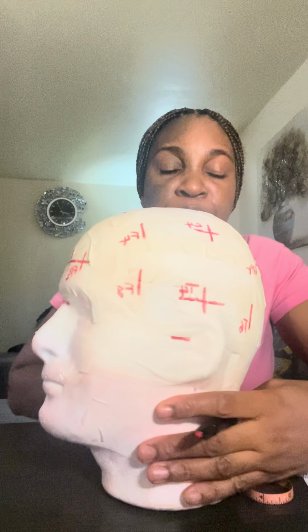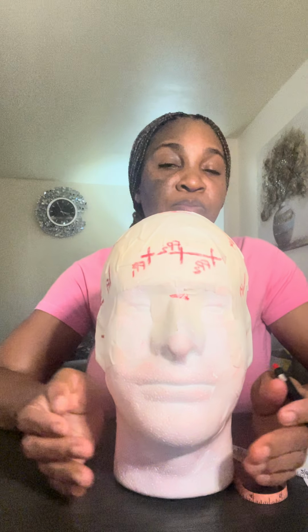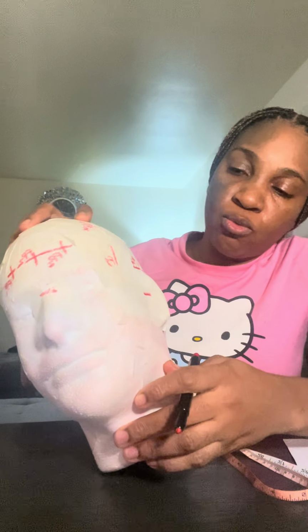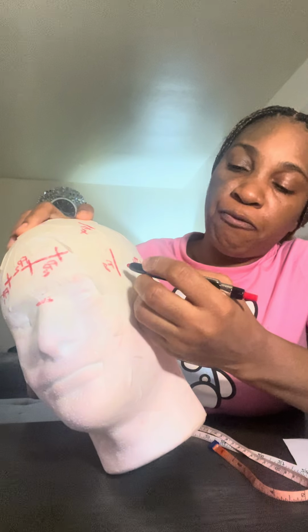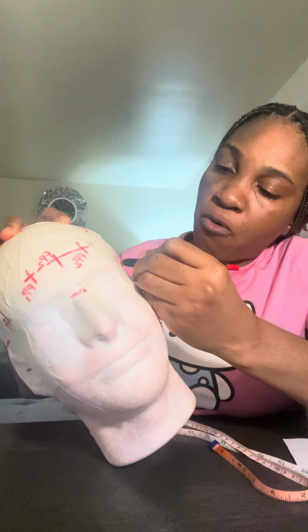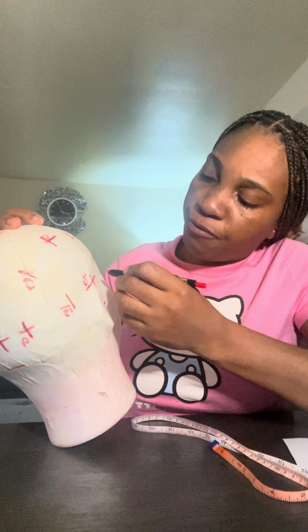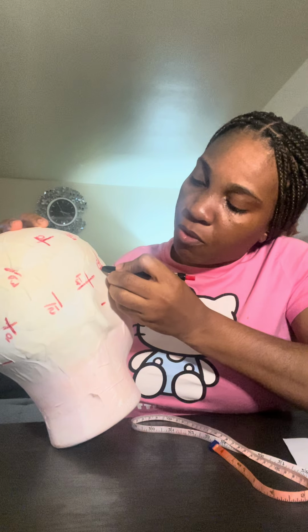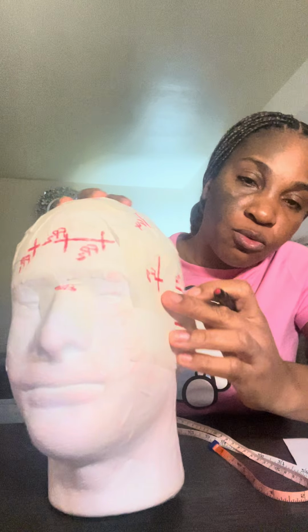All right. The next measurement is my anterior measurement and posterior measurement. Before I start, I'm going to make my true lines. For the anterior, I'm going to make my true line on F8 and F7, a straight line coming from T4. For my F7, the same thing, a straight line coming from T3. So those are my true F7 and true F8.